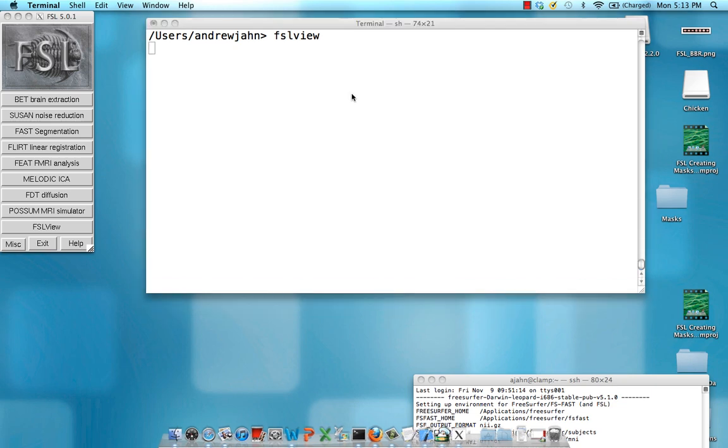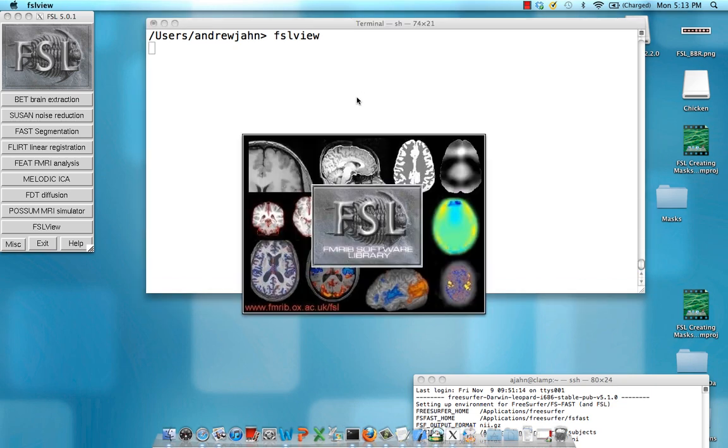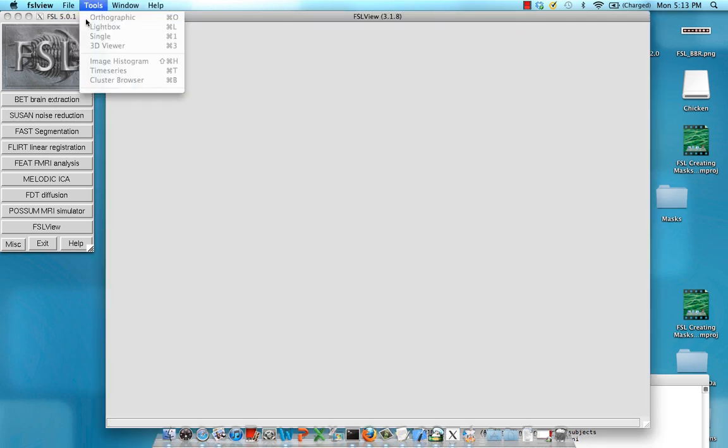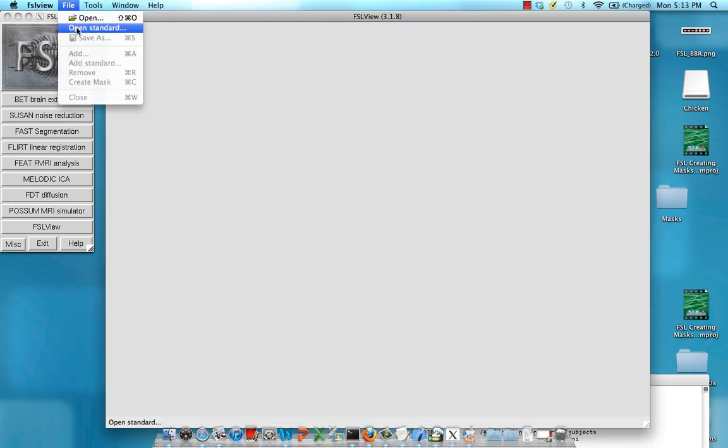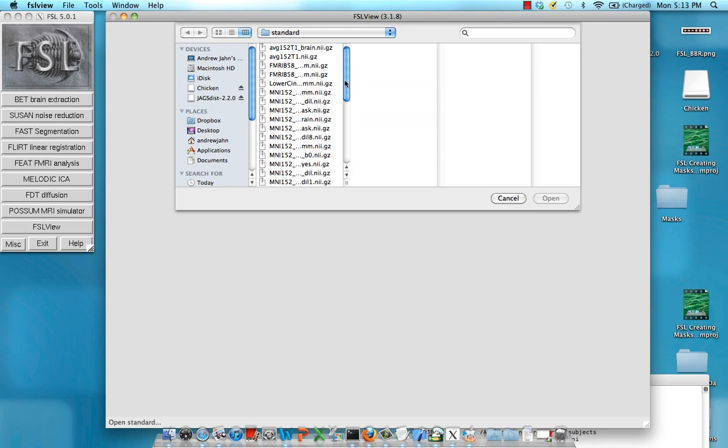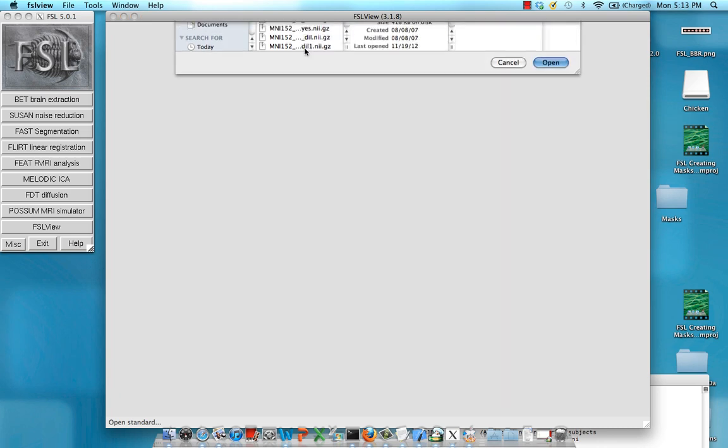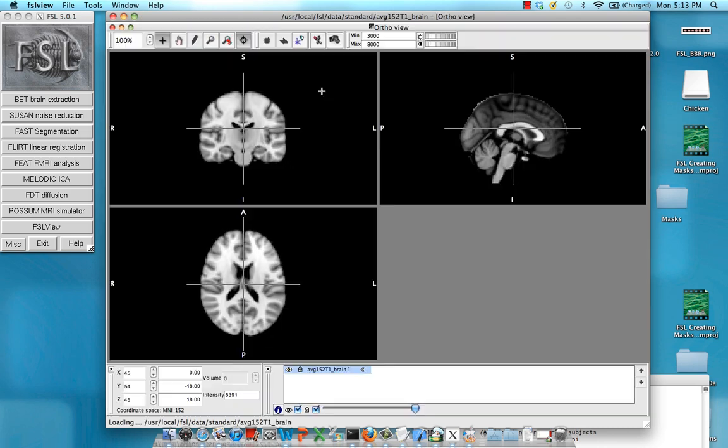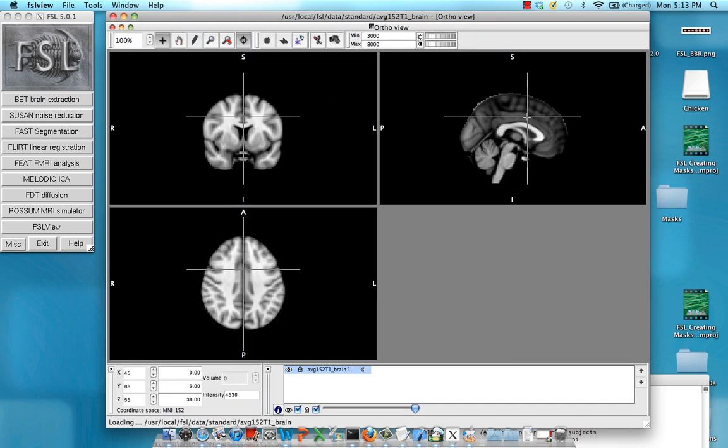You can do this through FSL view. Just open up one of these standardized spaces, like this average 152 brain.